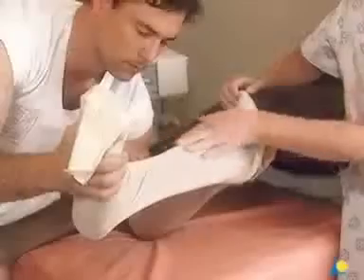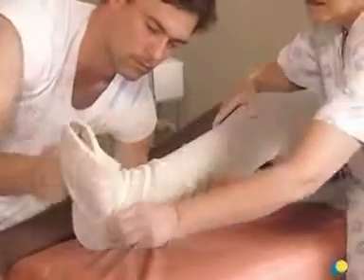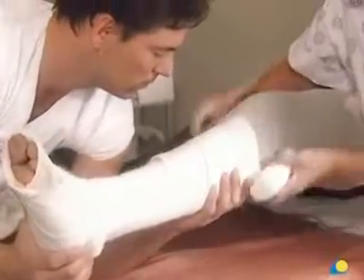After reduction, the leg is supported by an assistant. To begin, a stockinette is applied and cut slightly longer than the final cast will be. Starting at the distal border, the cotton wool is gently wound on, once around the foot and then around the ankle in a figure of eight, making sure that the edge does not cut into the 90-degree bend of the ankle. The cotton wool is wound towards the knee, giving an overlap of 50%. The overlap creates a double layer of padding, which is sufficient in most cases.